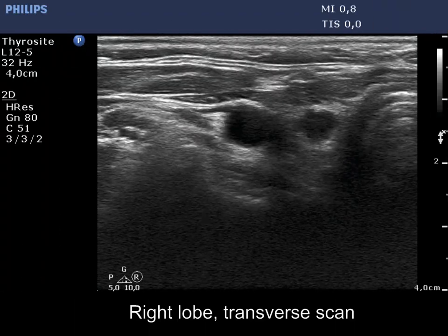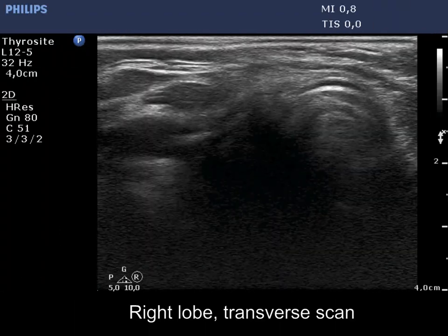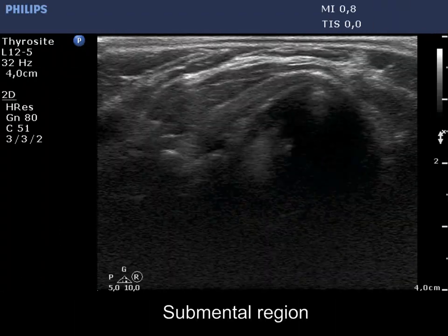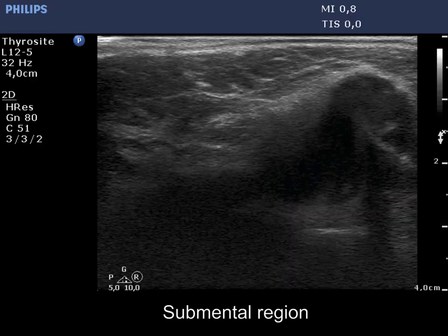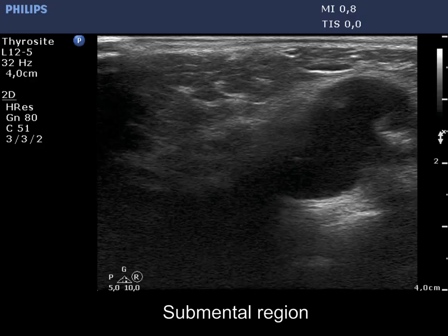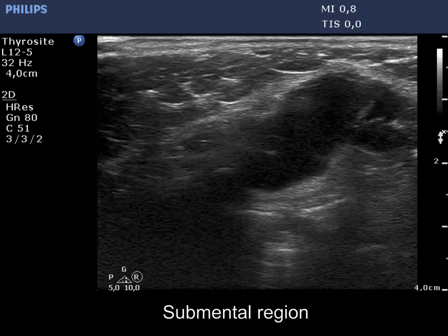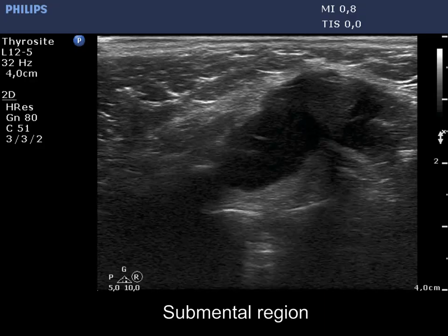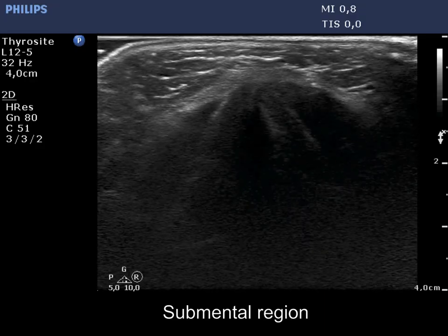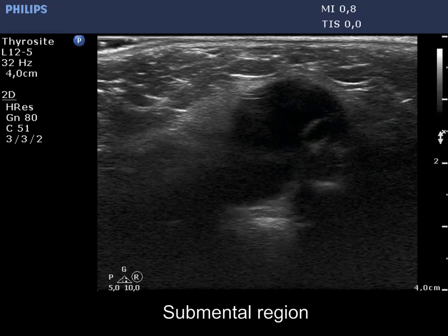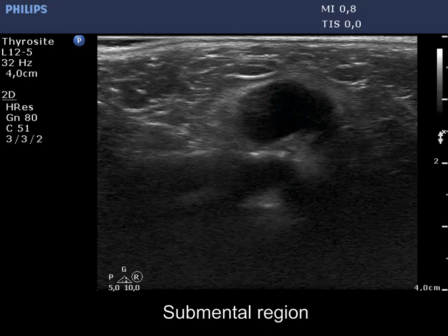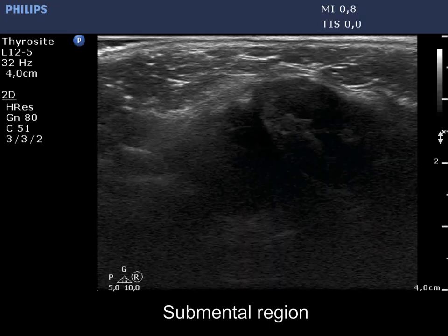First, the operated right lobe with a small hypochogenic remnant. And now here is the cystic mass in the submental region. The borders of the cystic lesion are not obvious.